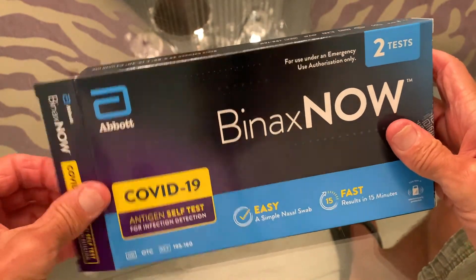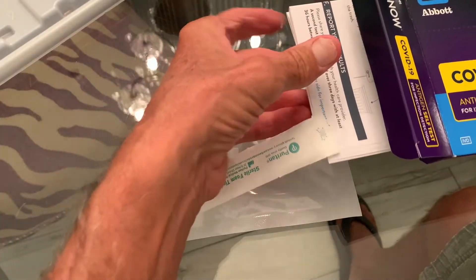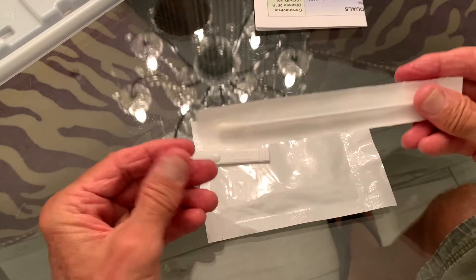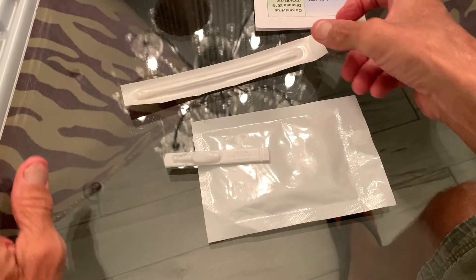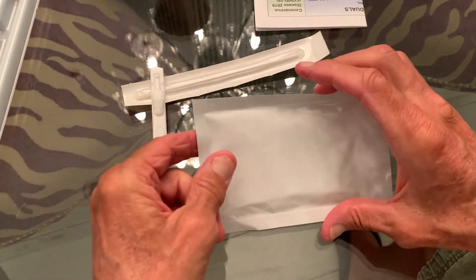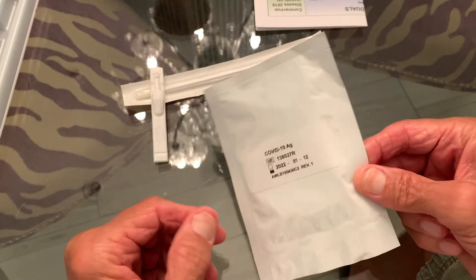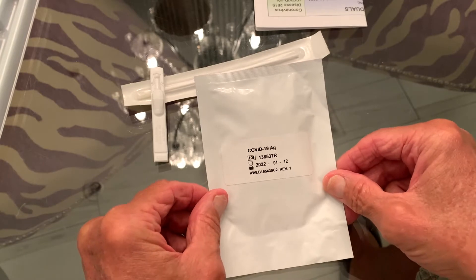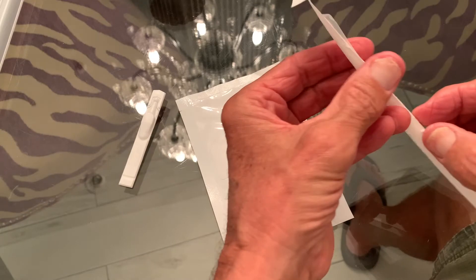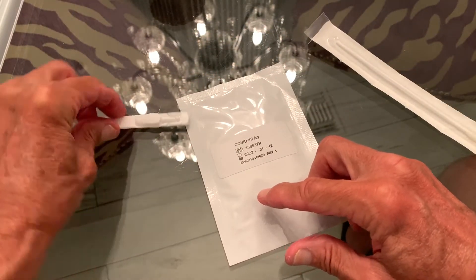We've already done one of the tests, so we're going to do the second one. It comes with a bunch of stuff. You get your swab right here, this is the reagent that you need to use, and your hermetically sealed card is in here. These are the three things you get: your swab, your card, and your reagent.